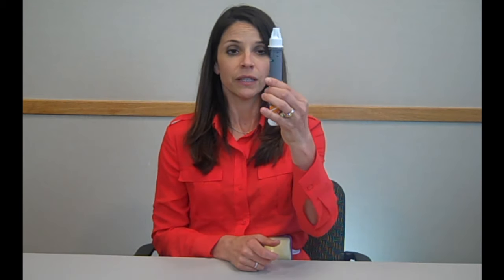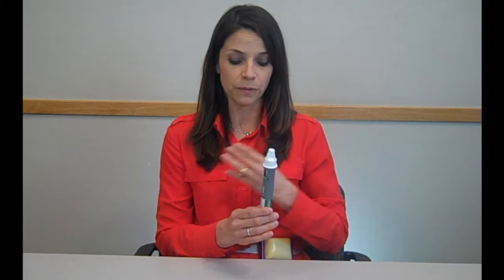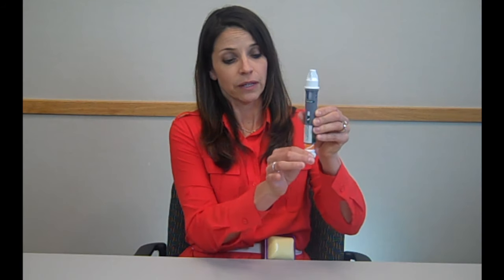You can check it again. Once it's uniformly cloudy, you're ready to inject. You can inject into your abdomen, the tops of your thighs, or the backs of your arms. To load your dose, you're going to twist the orange label and your injection knob will pop out and you'll hear a click.